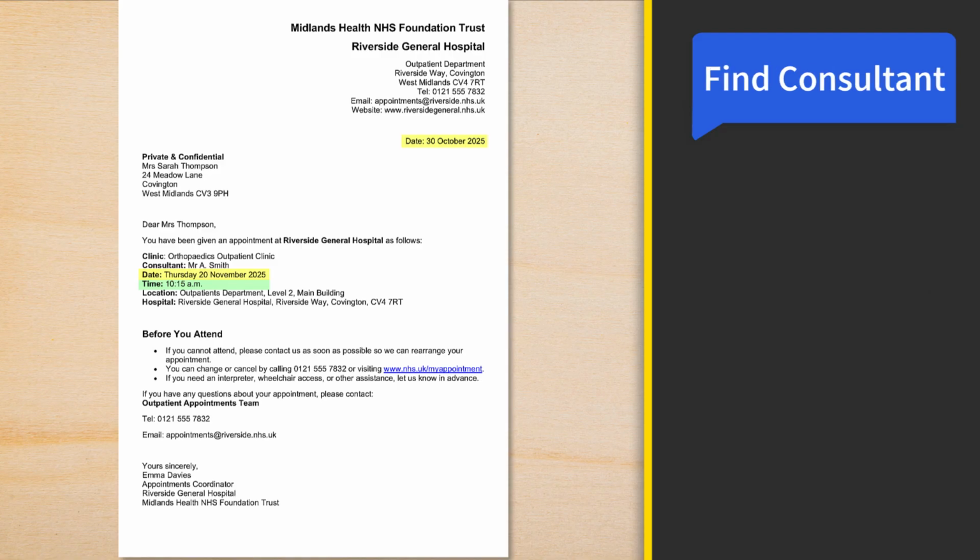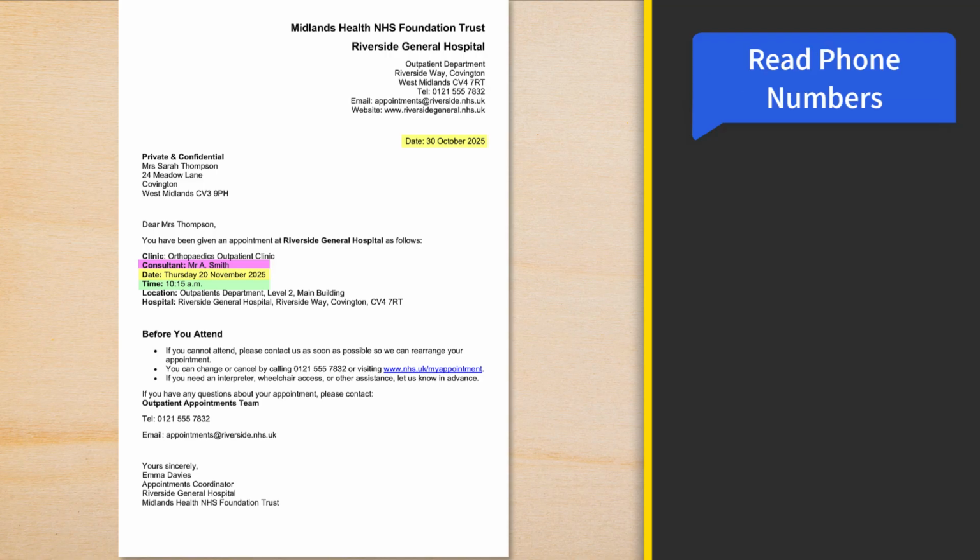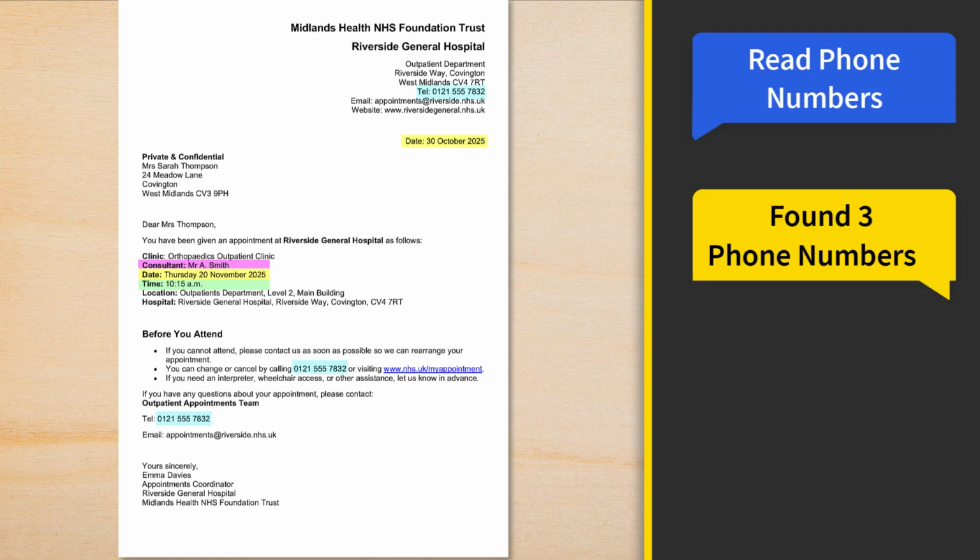Outpatients Department. Find consultant. Found 1 result of consultant. Clinic. Orthopedics Outpatient Clinic Consultant, Mr. A. Smith. Date, Thursday. Read phone numbers. Found 3 phone numbers. First result, 0 1 2 1 5 5 5 7. Exit.